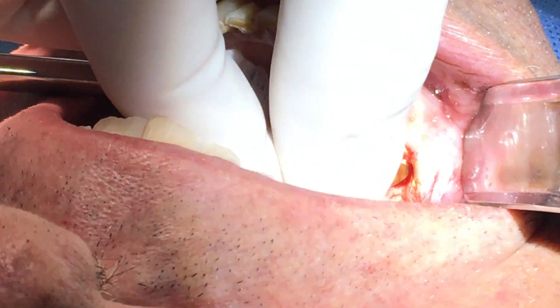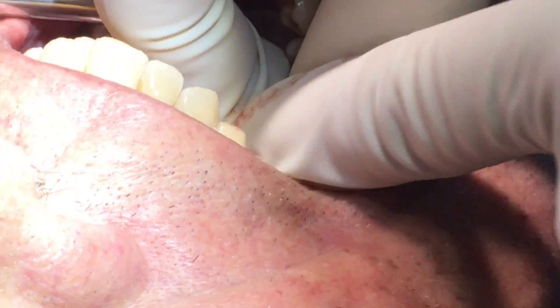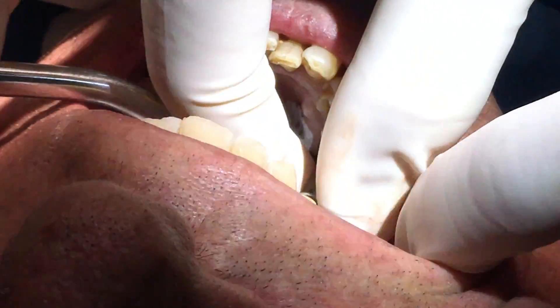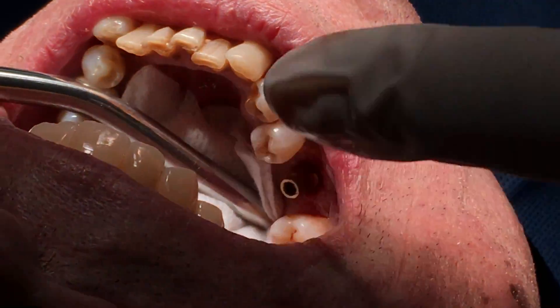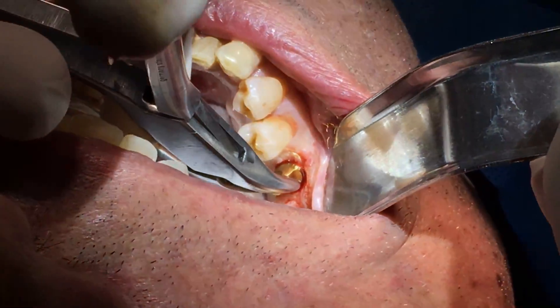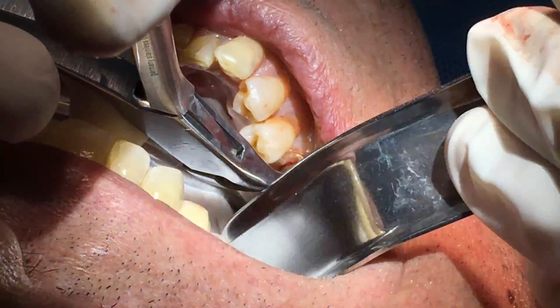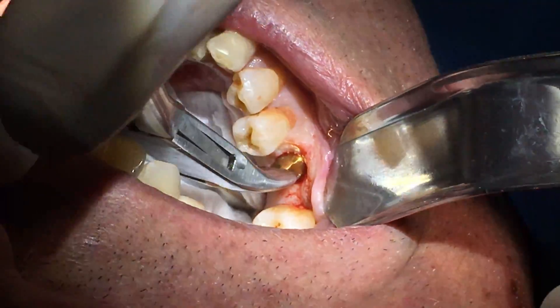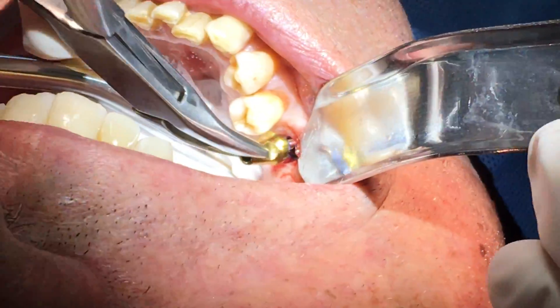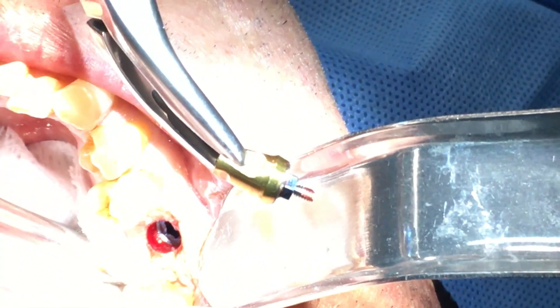I'm going to remove the abutment, which is also the key carrier for this implant system. So that's the abutment, and that will later be used to connect the crown to the actual implant which is in place.